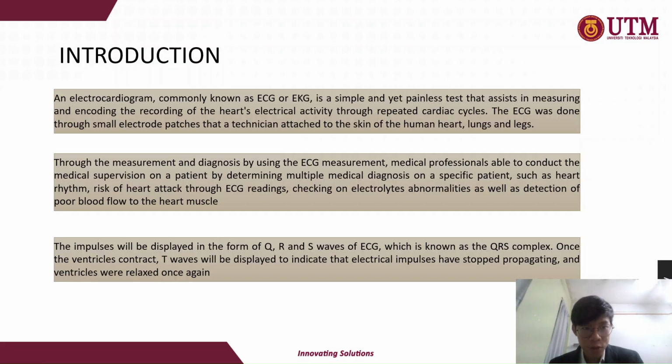In the introduction, an electrocardiogram, commonly known as ECG, is a simple and yet painless test that assists in measuring and recording the heart's electrical activity through repeated cardiac cycles. The ECG is done on the patient through small electrode patches that an electrical technician or medical professional will attach to the skin of the human heart, lungs, and legs.